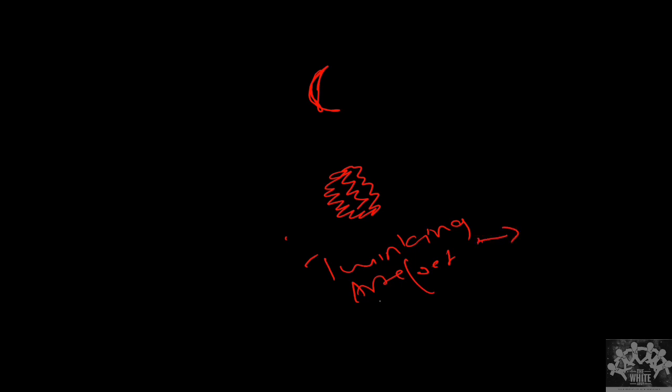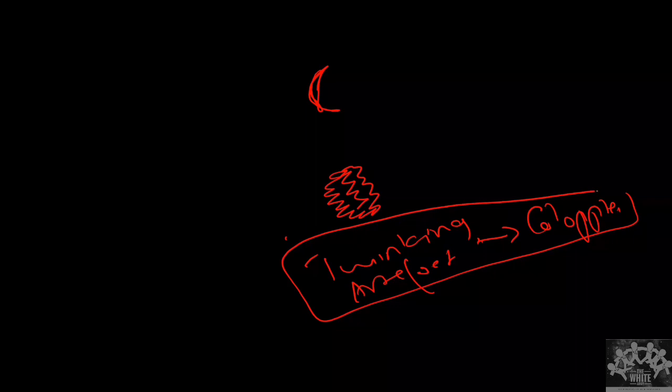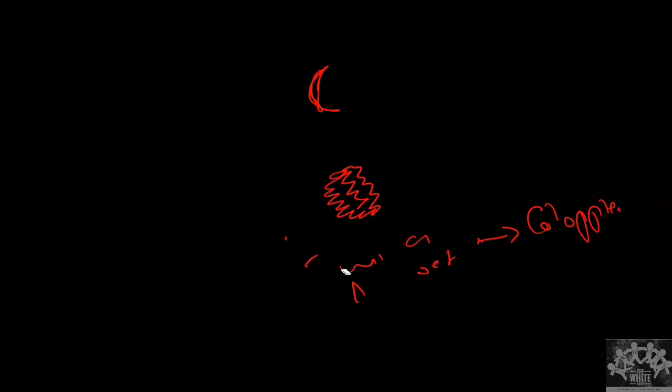Color Doppler is based on the principle of changing frequency when any sound meets a moving object. I'll tell you about the twinkling artifact when I deal with Doppler, but remember it now. So what exactly does the twinkling artifact do? Whenever the sound comes here, the stone is not a regular surface. It has a very irregular surface, so the ultrasound can hit at any point of the surface. So the reflected sounds are all at different frequencies.